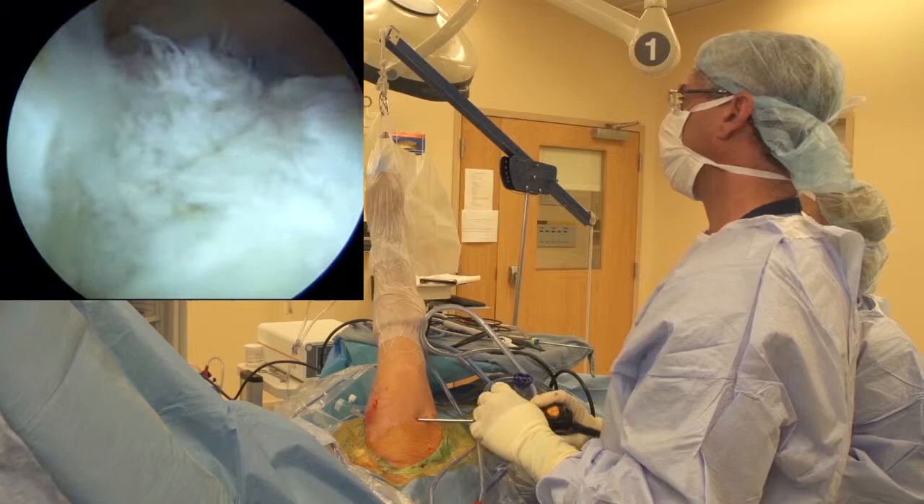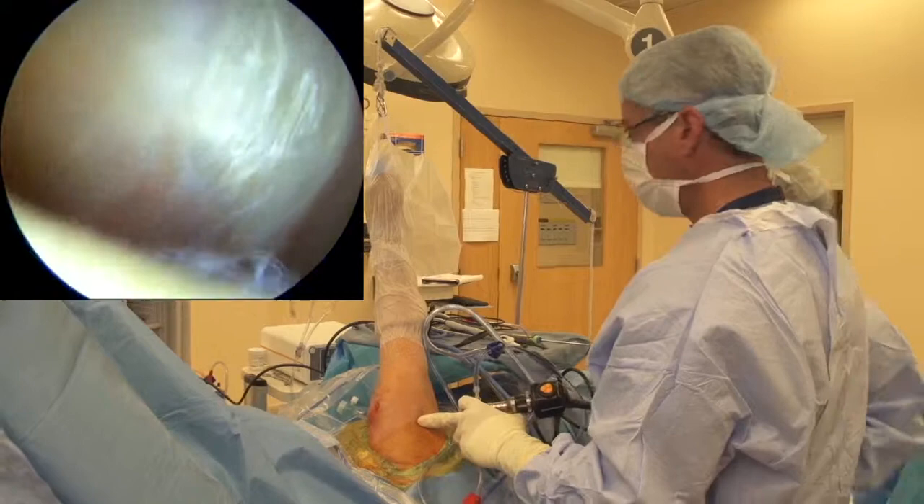Nice, broad, thick tendon - so this should be a really good repair. We're going to hopefully get a very stable construct associated with this.